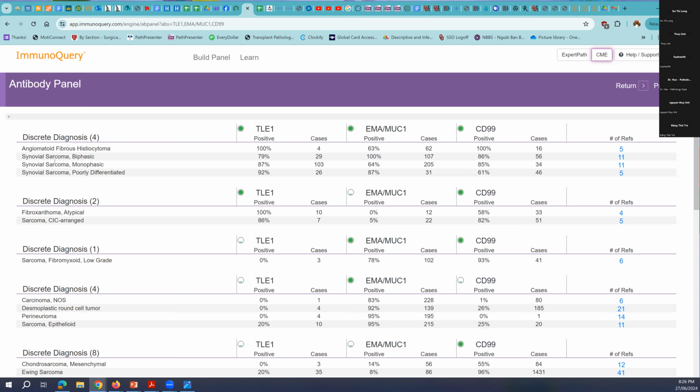But that doesn't usually have necrosis. It usually has a cuff of lymphoid cells and an admixture of inflammatory cells. So this is not fitting very well here.